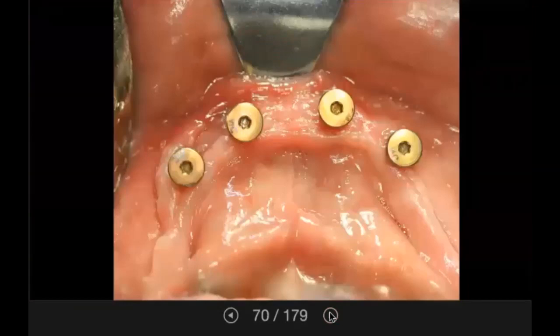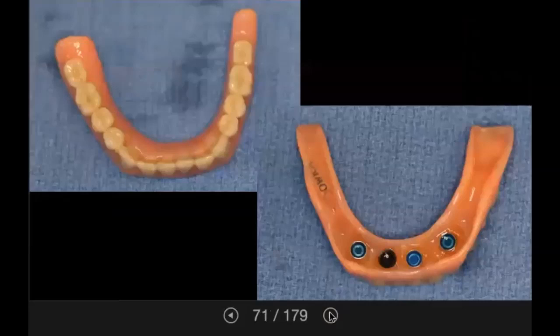The patient presents 6 weeks status post implant placement with total tissue healing and ideal implant osseointegration. The pre-existing mandibular denture in this case was retrofit with locator housings.